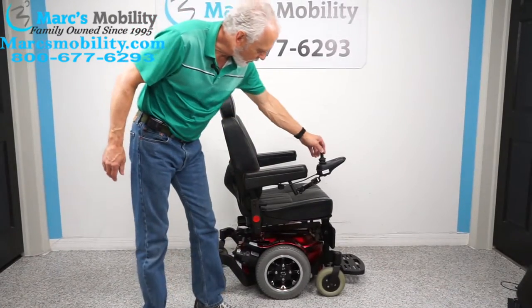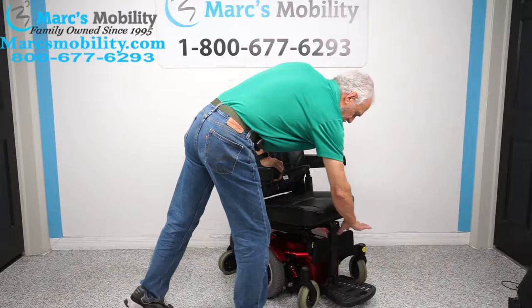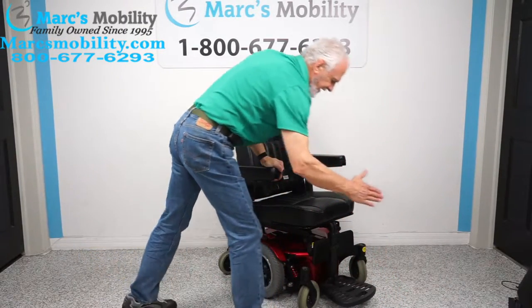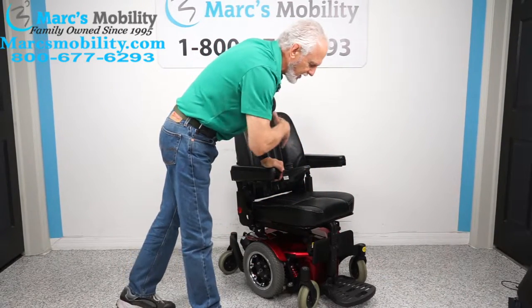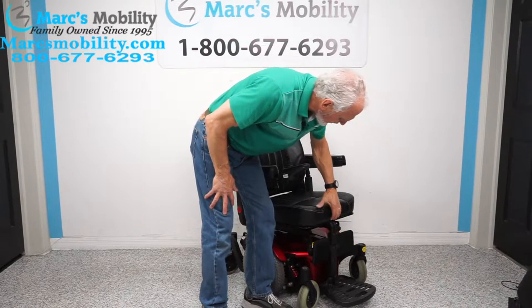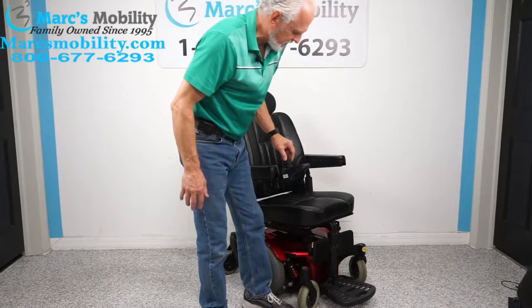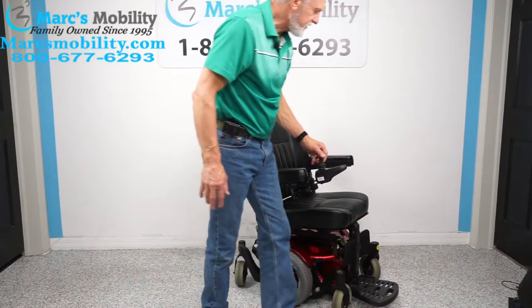It's really fast and very compact. One thing we can do if needed: the foot plate can be moved forward — all the way up to here. Right now it's set up as close to the chair as possible, so if you're in a house you have the best turning radius. This whole front end can be moved forward two or three inches.